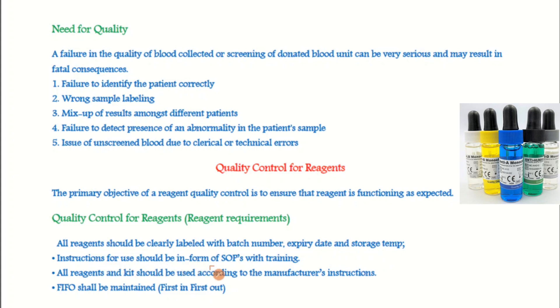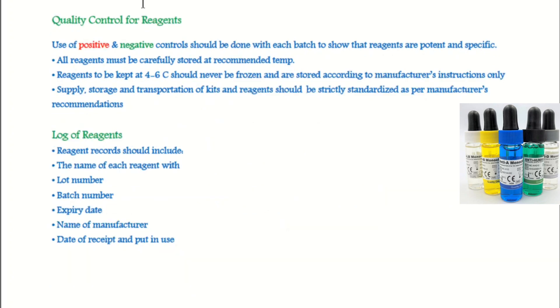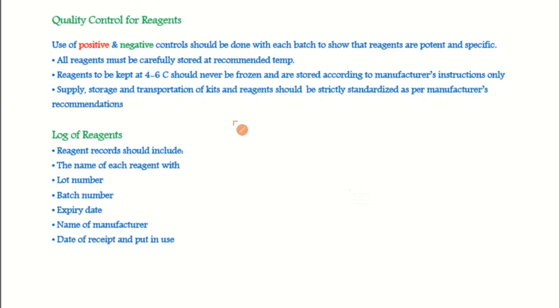Instructions for use should be in the form of SOPs with training. All reagents and kits should be used according to the manufacturer's instructions. The FIFO rule — First In, First Out — should be applied to both reagents and blood components. To ensure reagent quality, positive and negative controls should be done with each batch to show that reagents are potent and specific. All reagents must be carefully stored at the recommended temperature. Reagents to be kept at 4 to 6°C should never be frozen. Supply, storage, and transportation of kits and reagents should be strictly standardized per manufacturer instructions.